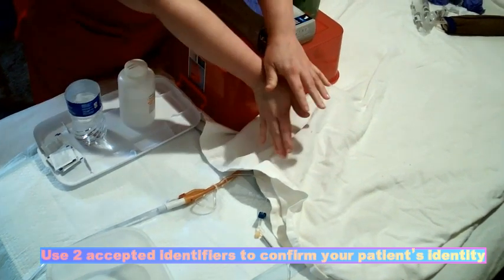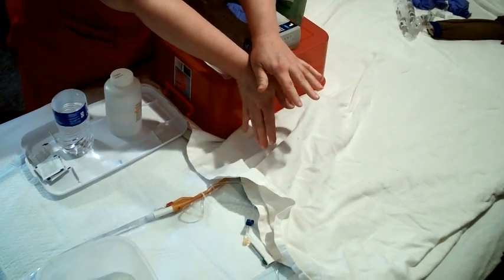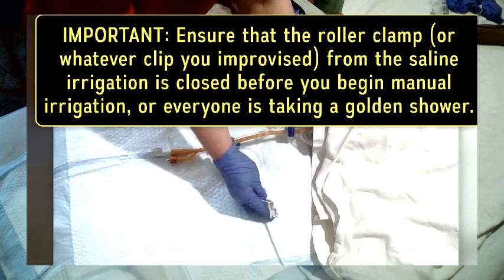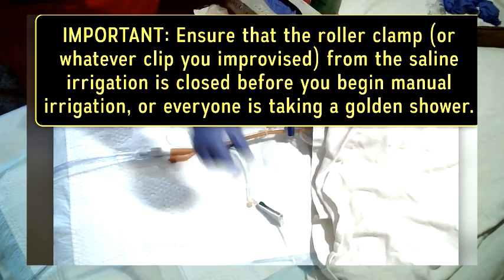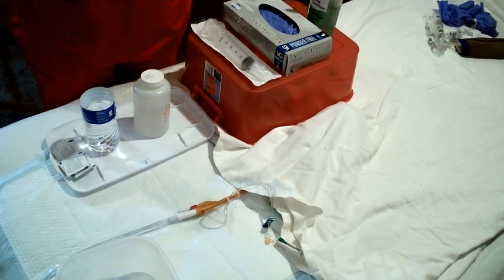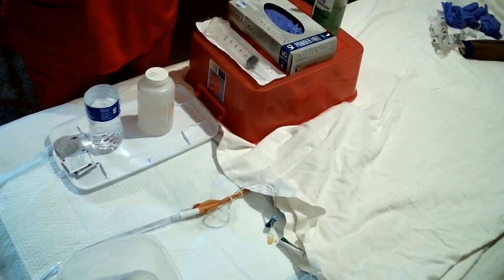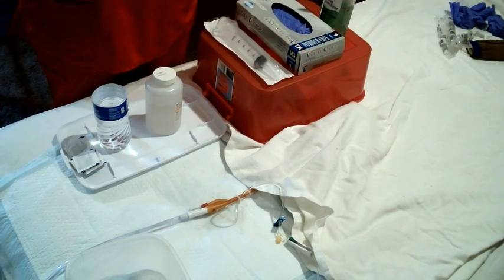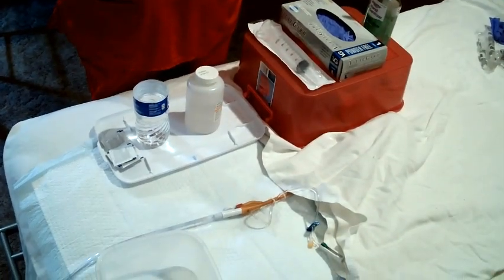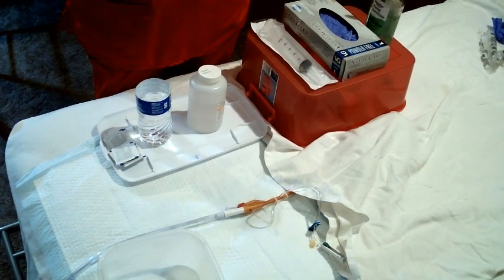All right, so I'm just going to press a little bit. You are kind of distended. So what we're going to do is first we're going to clamp that Foley. It looks like you have about 600 out. So what we're going to need to do is irrigate your CBI. You've got a clot obstructing your tube, and we need to get that clot out of the way so that we can empty your bladder. Is that okay with you?